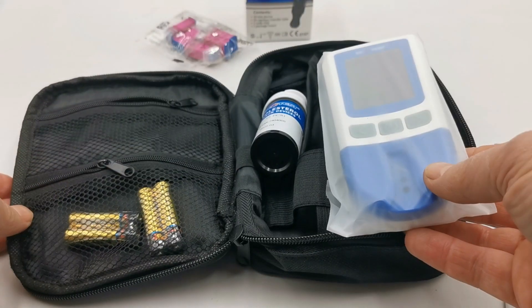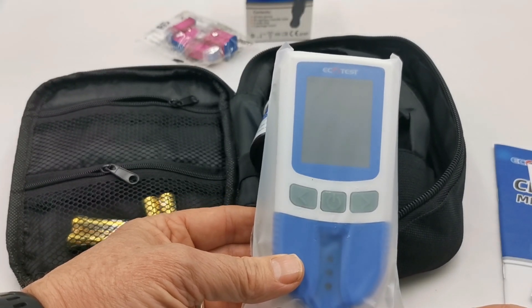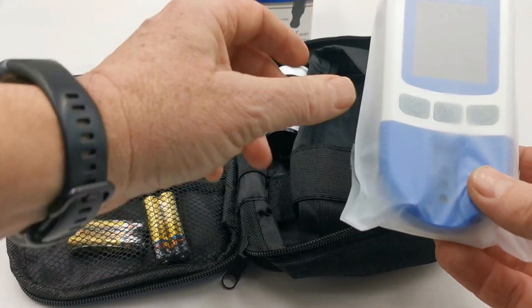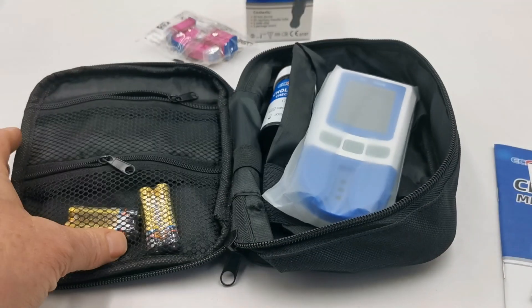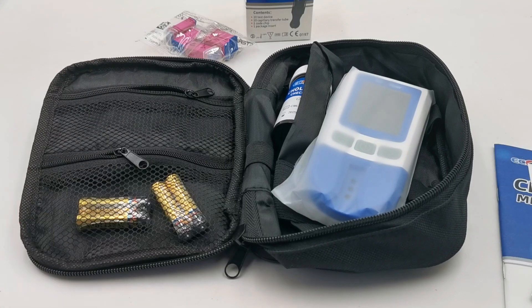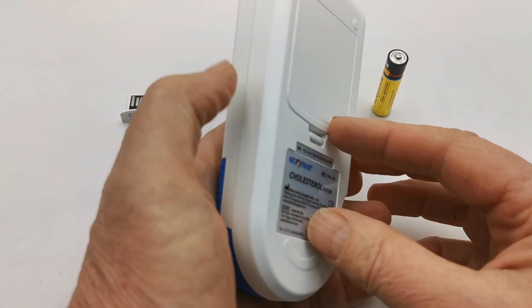What we're going to show you next is inserting the batteries and setting the time and date on the meter, so that when you come to do your first test it will record the time, date, and readings that that test shows. In this section we're going to demonstrate how to set the time, date, and year on the meter before performing the first test.